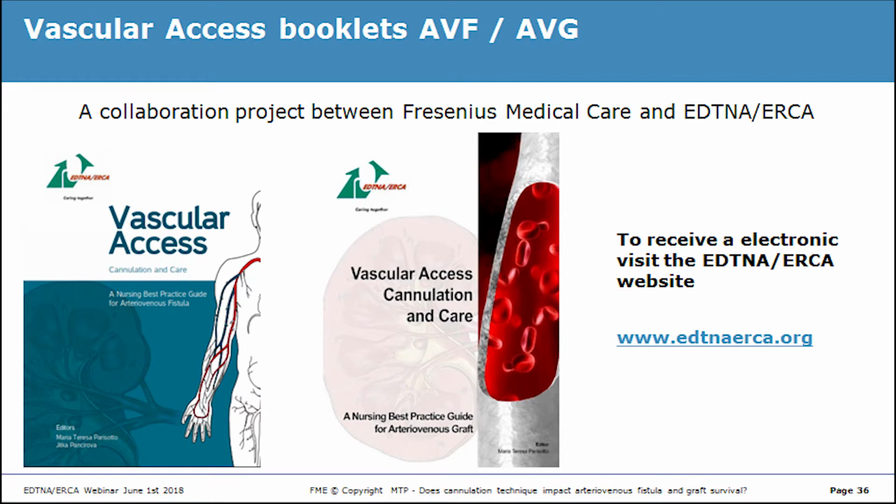Well, you can use the short needle only if you have a very superficial vascular access. Because if you have a vascular access that is not superficial, to reach it you are obliged to have a 30-degree or more angle. And we saw that the angle is important for the survival of the vascular access, because if you have a too deep angle, you can have a lot of turbulences. So you can use it only if you have a very superficial vascular access.